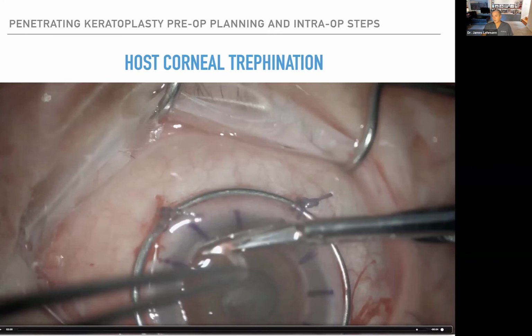Dr. Aravind Roy asks, what should you do if you have cut the iris inadvertently? Normally when you cut the iris, it's cut during trephination or with the scissors.